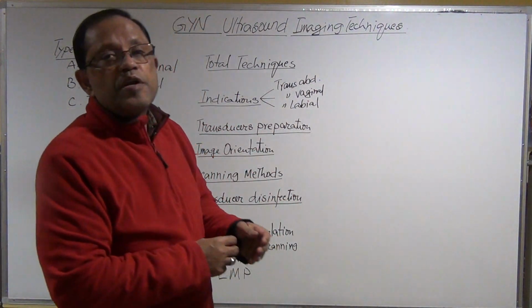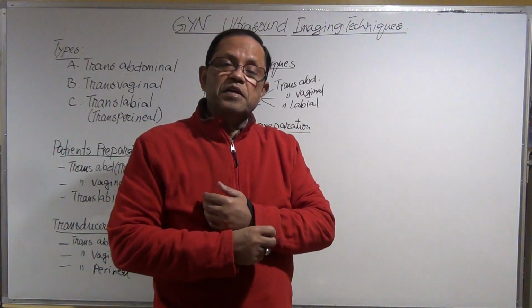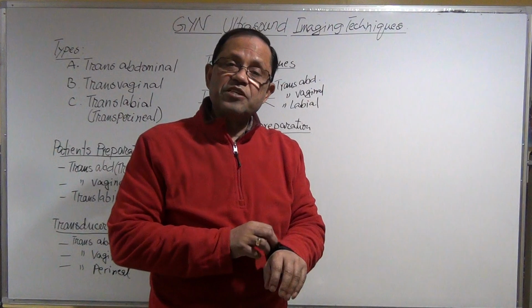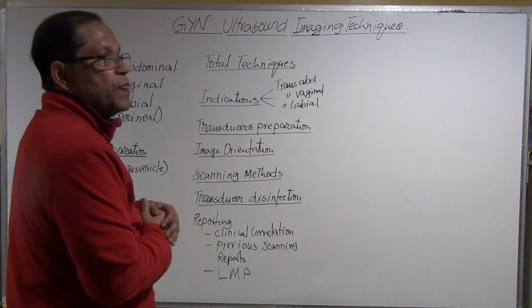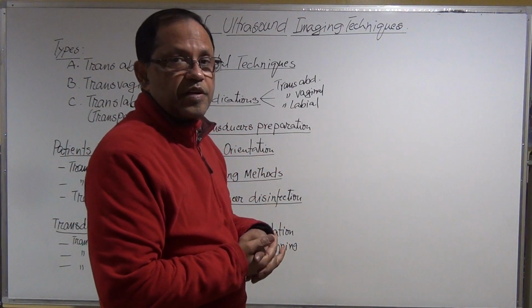What does trained operator mean? It needs a trained sonographer, those who are national standard, that means registered sonographers. Okay?